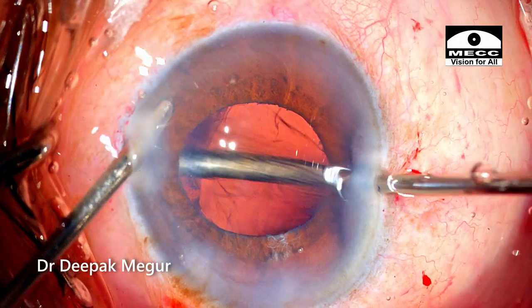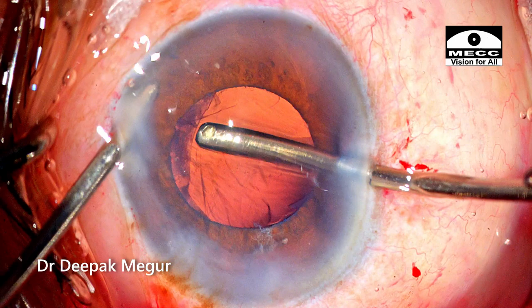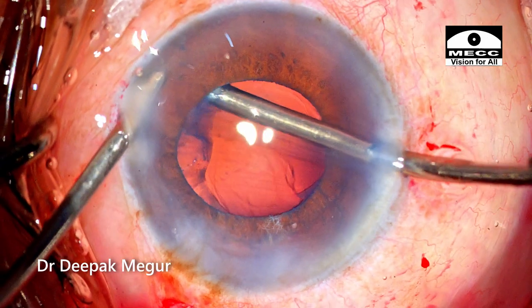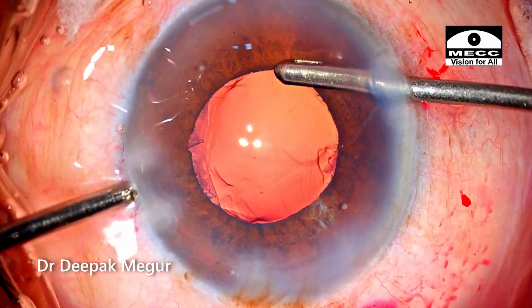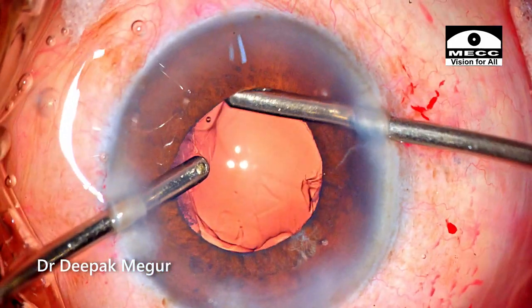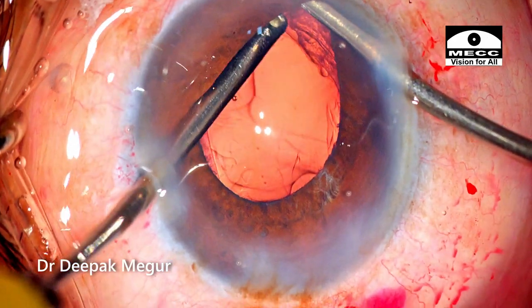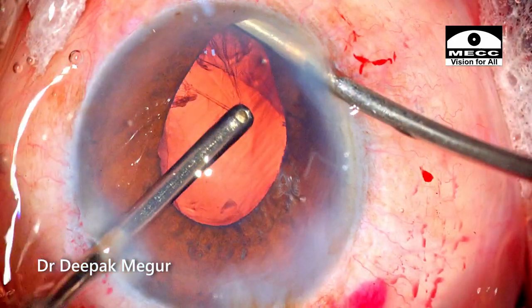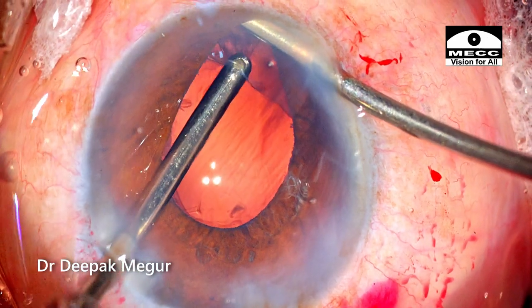At this point, I am suspicious of a localized area of zonular weakness here. I might have just caught the bag itself. I switch hands and go in to the other quadrant. Retracting the iris with the irrigation handpiece is a great way to visualize what my aspiration probe is catching when the pupil is not adequately dilated.